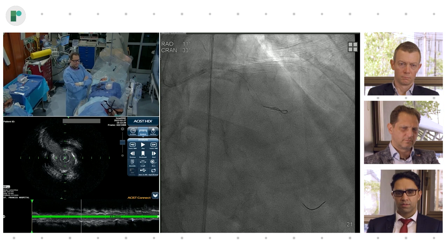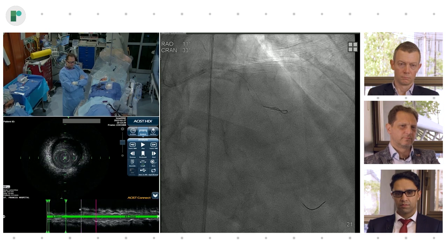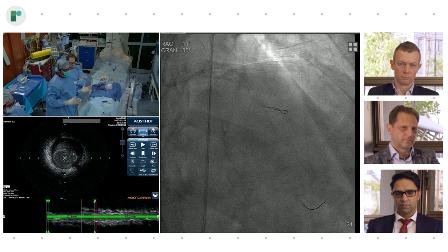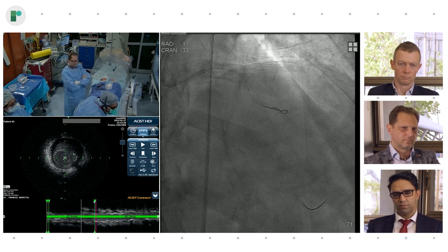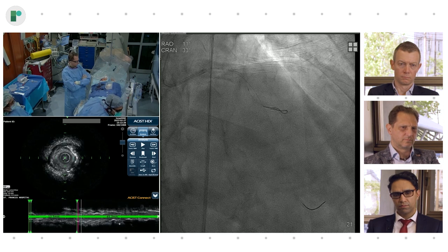So what I'm going to do is just bookmark that spot. And so by bookmarking that spot, I can actually do a second measurement and say that 12 millimeters from the distal edge is how far we can use a 3.0. So really, we'll take a 3.0/12. And then all the way proximal to that, we can actually use a considerably larger balloon.